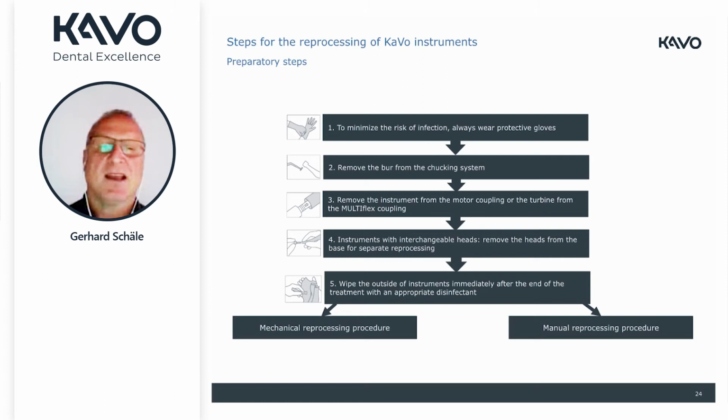To oil it, in the QuattroCare, for example, there is not absolutely a need to remove it from the head, but we give the possibility that, of course, you can spray it separately as well. Of course, you should wipe the instruments immediately after the treatment, just for the safety of the staff, before it goes to the mechanical reprocessing or to the manual reprocessing.